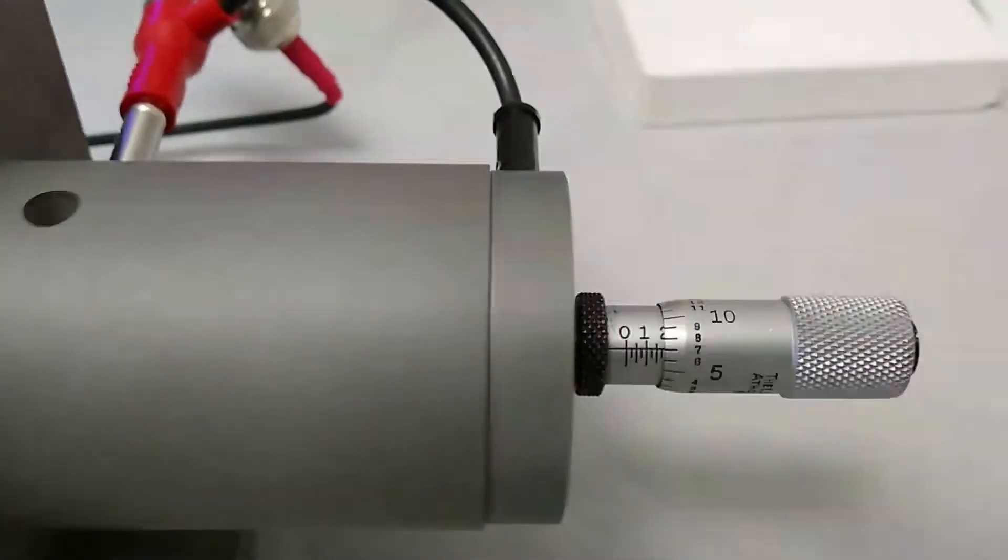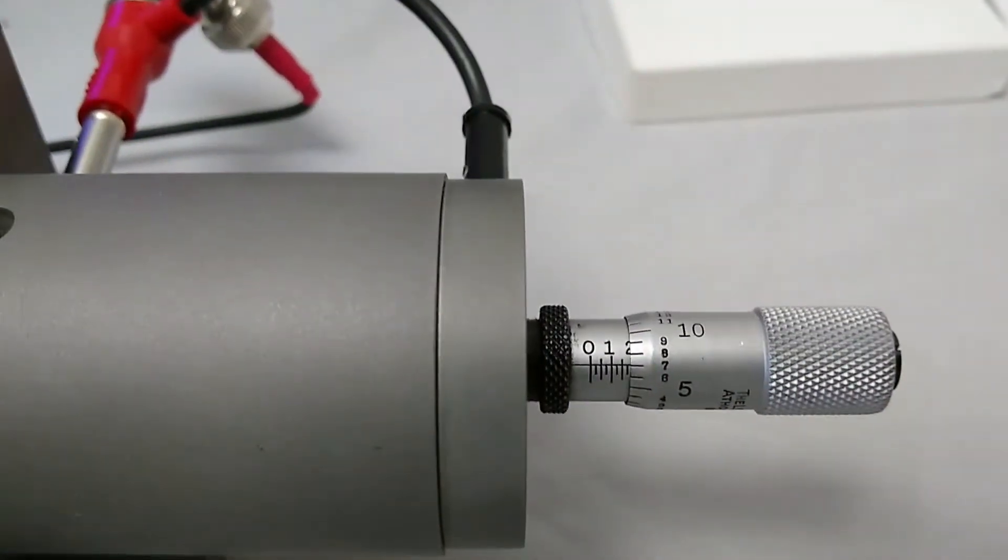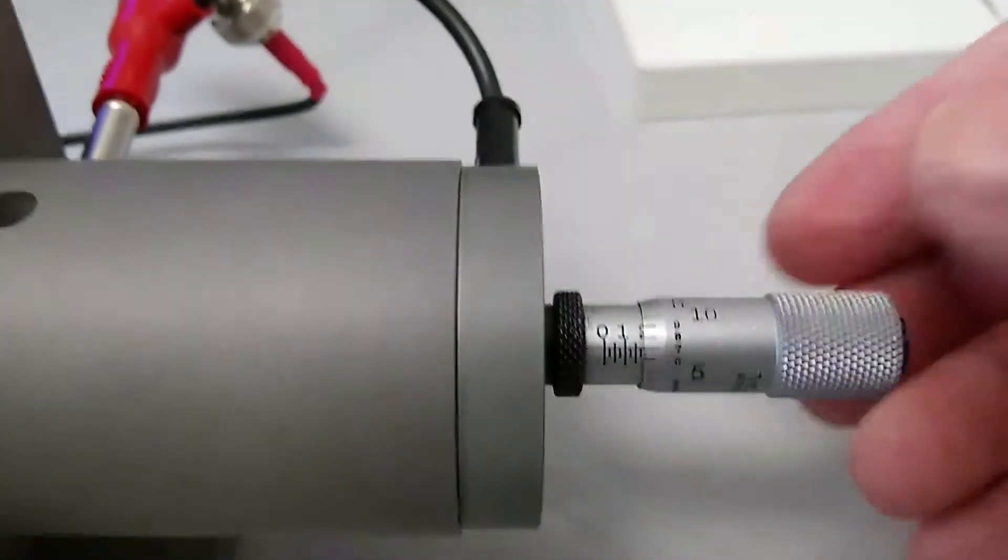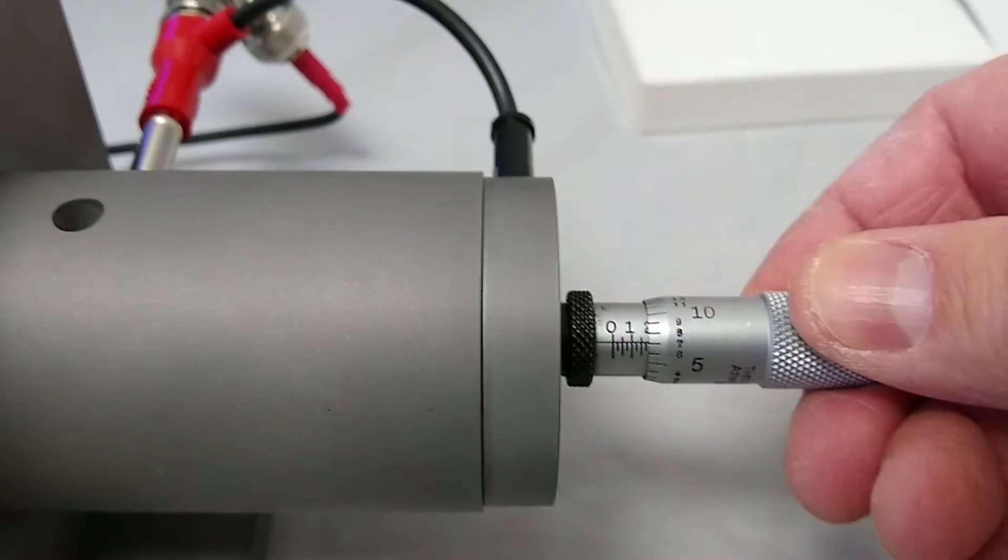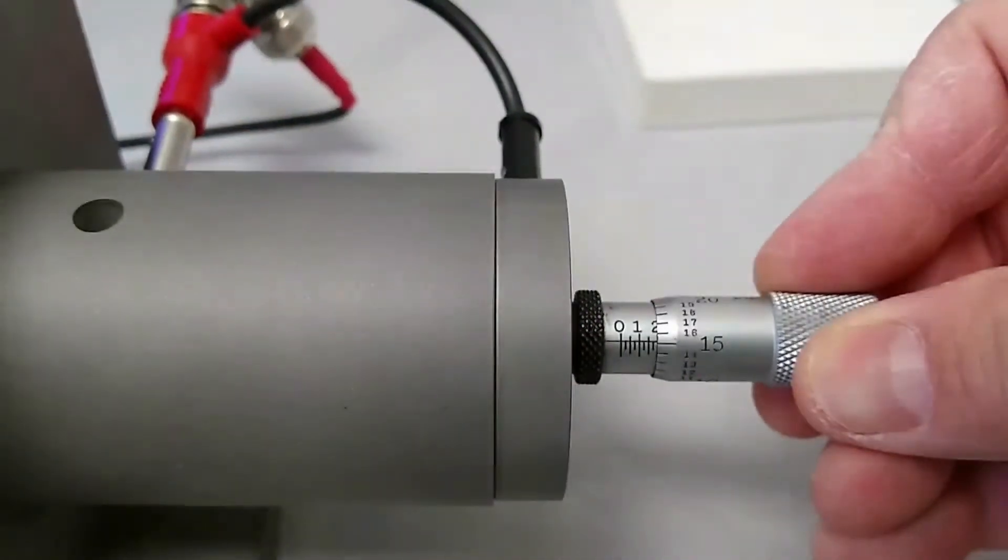So now that we've got those two values written down, we also take a look at the micrometer and see what the micrometer setting is. Once we've done that, we can basically loosen up the micrometer. So we're basically at 7. We can loosen up the micrometer to say 15.